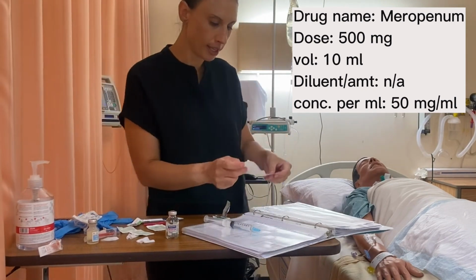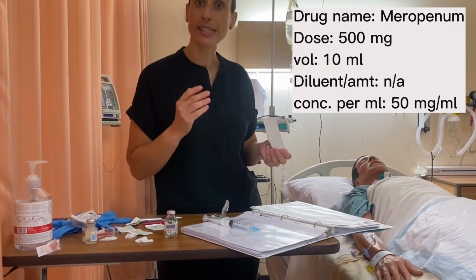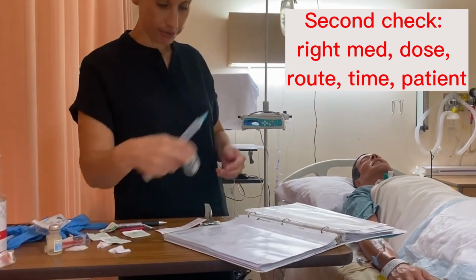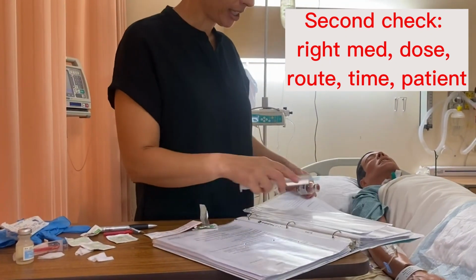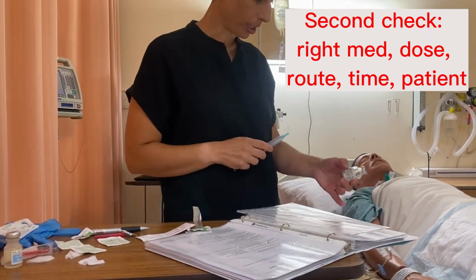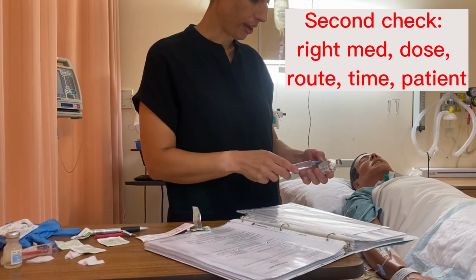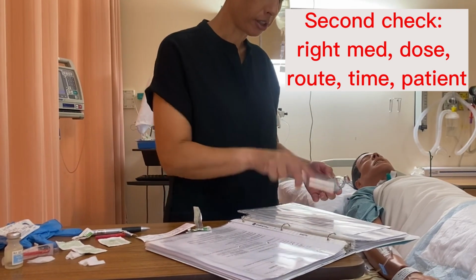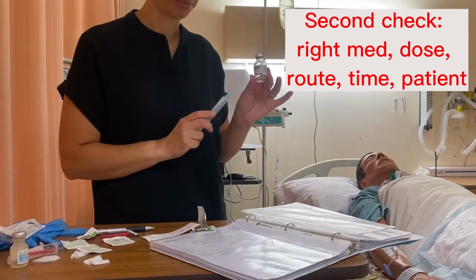Okay, now we can label this medication as well. So I filled out my label, and then this would be a great time to do our second check. So with my syringe in hand, also with my vial, I'm gonna take a look at my PDM and also my MAR. So my MAR, Meropenem, that's what I have here. I have 500 milligrams, 500 milligrams. It is IV, it is due now, and it is for the right person. So I have done my checks here.